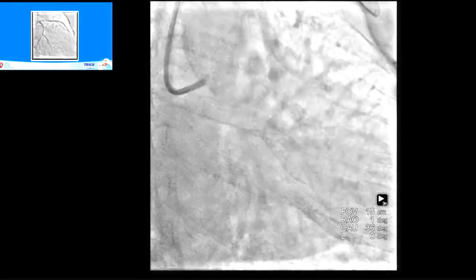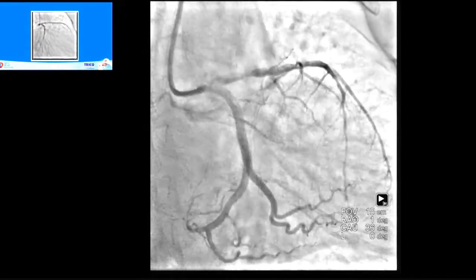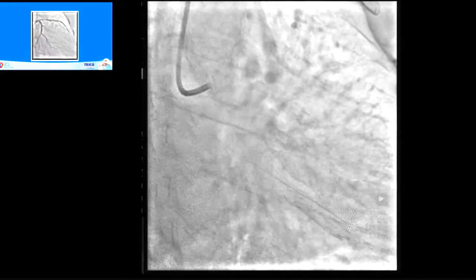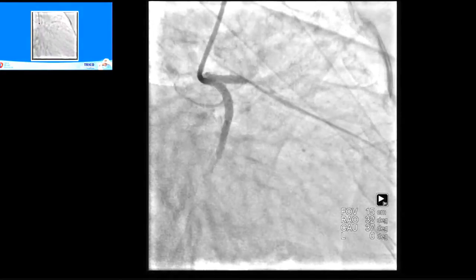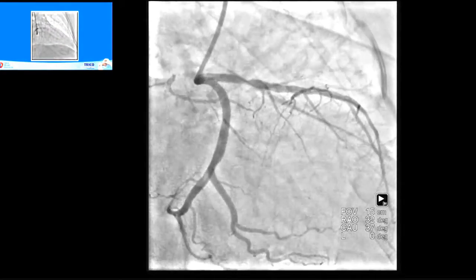Our next case is a 72-year-old woman with a history of hypertension and diabetes, presenting with recent non-ST-elevation MI, class 3 post-MI angina, and severe LV dysfunction. Angiogram showed a 95% lesion in the proximal LAD. Our plan is to do robotic-assisted PCI into the LAD.